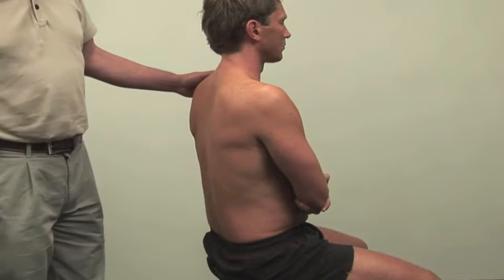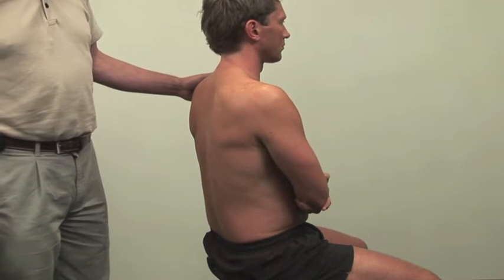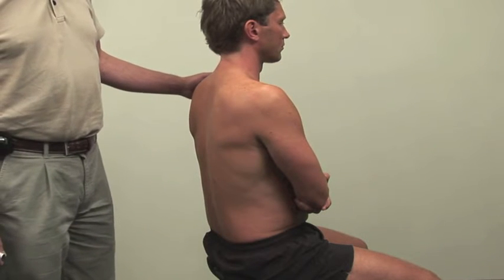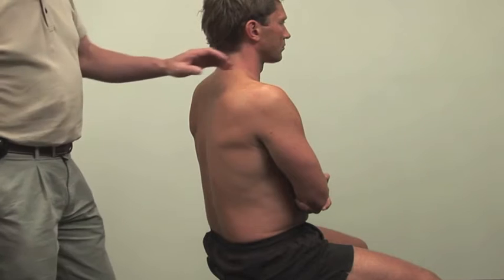Intraarticular injection of the glenohumeral joint. Patient in the sitting position with arms folded, thus opening up the posterior joint space.